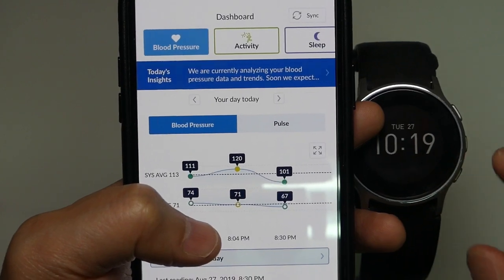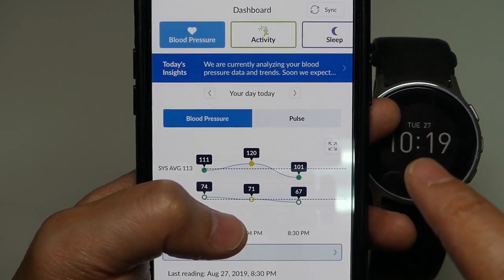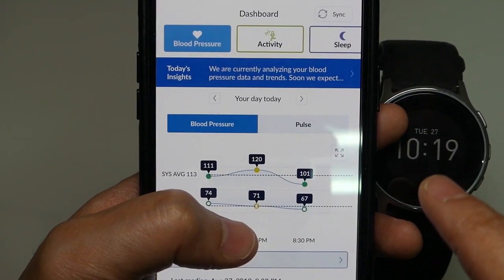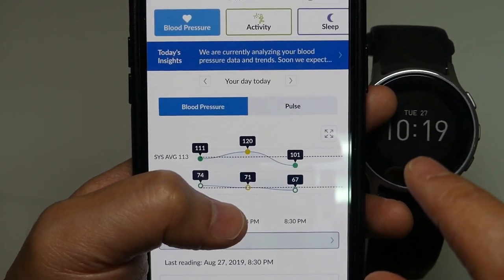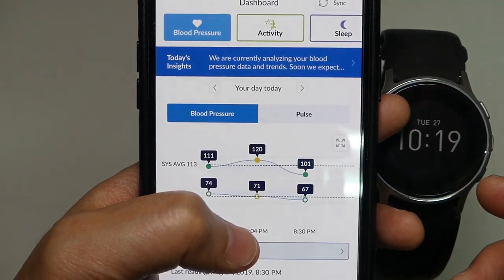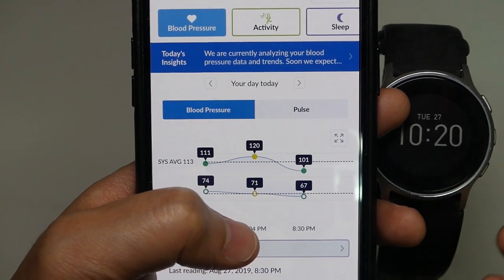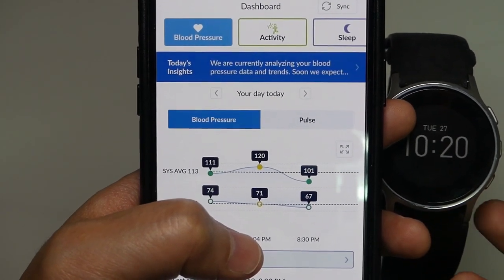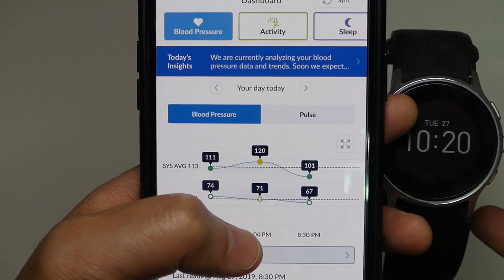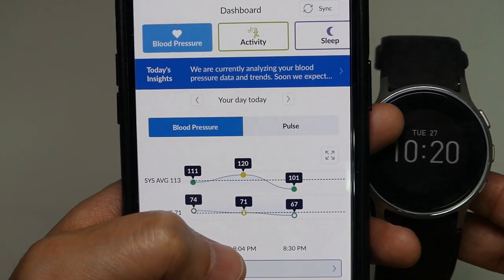For example, this smartwatch allows me to monitor my blood pressure anytime, anywhere. Actually, this is the main purpose of this watch. I usually take my blood pressure after a meal, before sleep, or after waking up, or while I'm taking the MRT or subway, or taking a taxi — anytime, anywhere, absolutely. So this is very convenient for me.